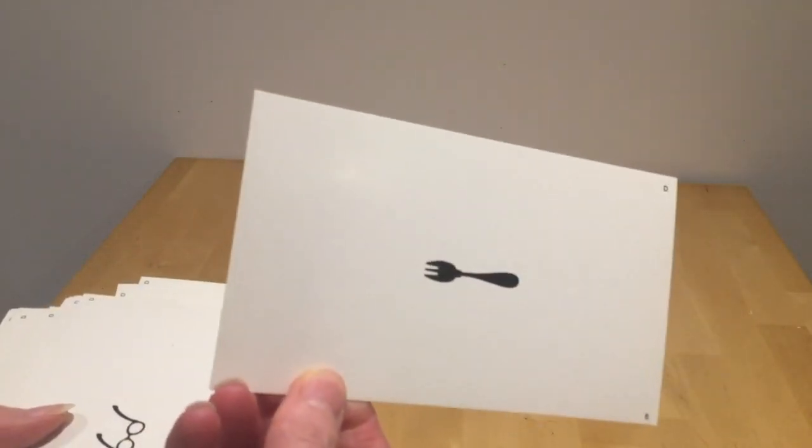And again, you're going to record when the child or young person makes an error. Here we have our fork at set 6. And note that down. Unfortunately, I don't have the correct recording sheet with me to show you how to record it, but it is fairly straightforward.